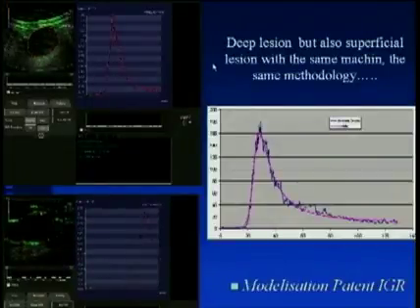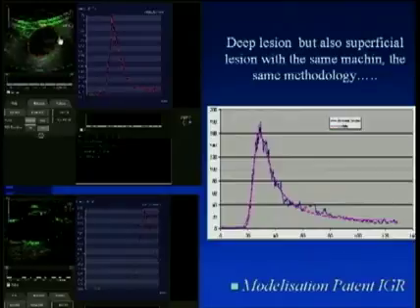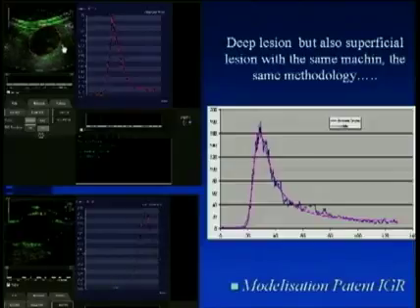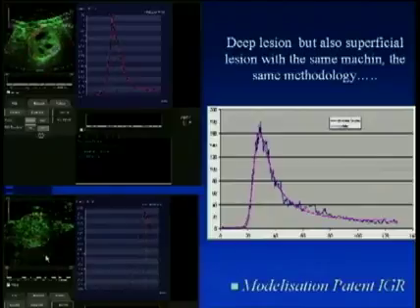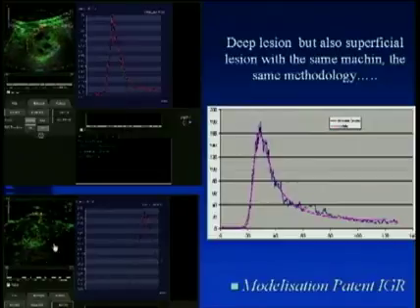So we developed a methodology for deep lesions, and for example, here this is a metastasis in the pelvic area, a tumor measuring about 6 centimeters. Here, this is a very small metastasis from melanoma. This is a tumor measuring only 1 centimeter. And finally, if the patient has only 1 very small metastasis, you are able to evaluate the treatments.